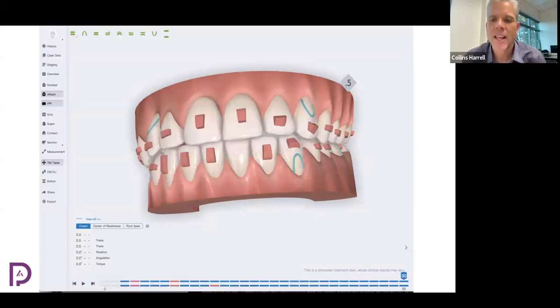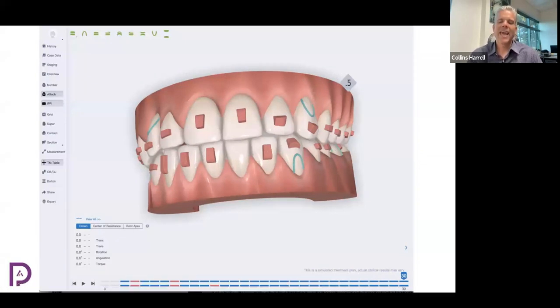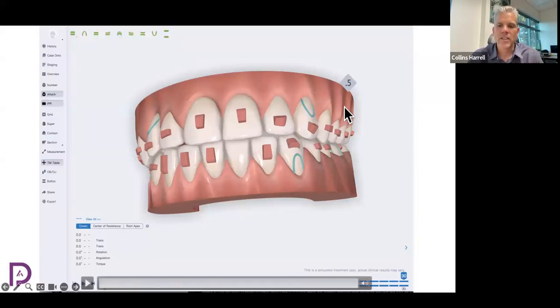And the reason is because when the aligners are in the mouth in a medium to strong muscled patient, as they bite on the aligners, the thickness of the aligners is relatively thicker in the back than the front due to the wedge shape of our jaw or mandible. As the upper and lower hit first, they're going to feel more intrusive pressure than the front teeth.